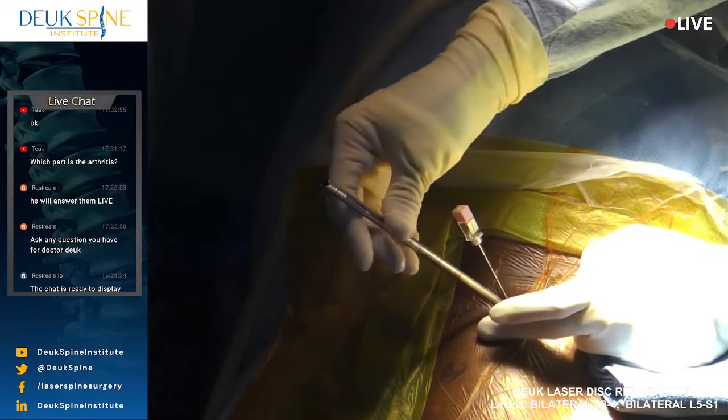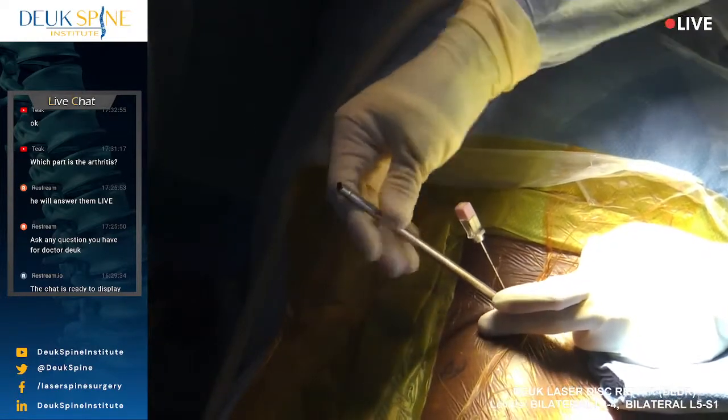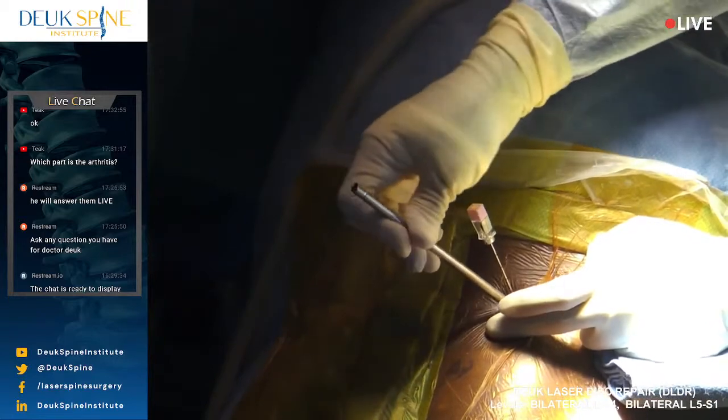Yes or no? Yeah, you're fine. Oh, okay. I'm just trying to think, why did it look like the guide wire was still there? That was weird.